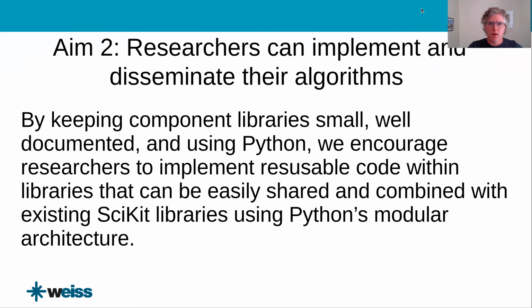And this last thing is all about the second aim, enabling researchers to disseminate their algorithms. With SciKit-Surgery, the component libraries are small and they're well documented. Instead of using C++, we're using Python. And this encourages researchers to implement reusable code within libraries that can be easily shared and combined with existing SciKit libraries using Python.